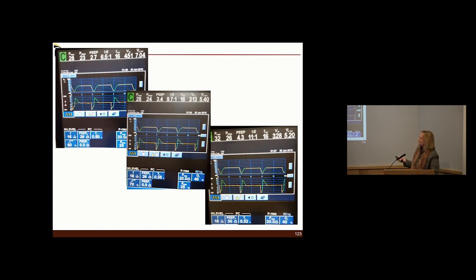So here is an example: this patient was already on APRV. But if you look, what percentage is this here? It's at least 50, right? If not 40%, okay? So what do we need to do? We need to reduce our T low. So we take our T low from 0.5 to 0.35. It's still not 75%. So we go to 0.32.